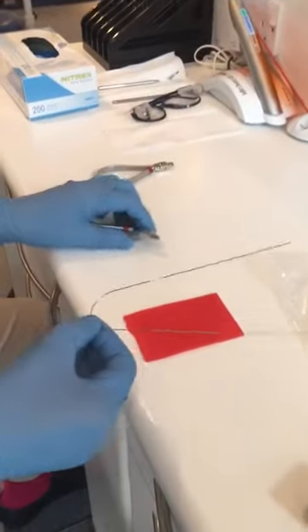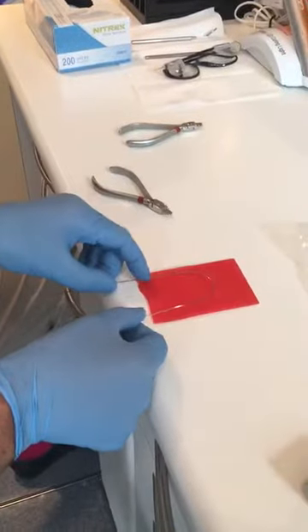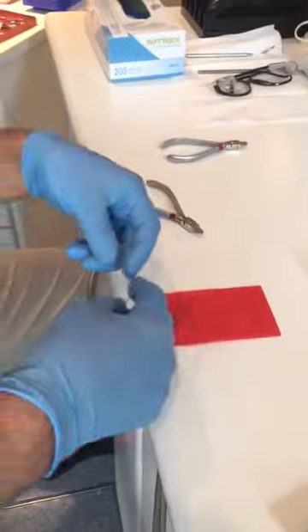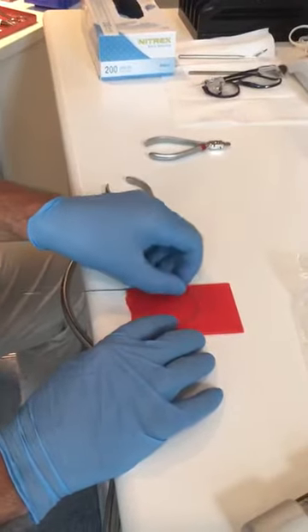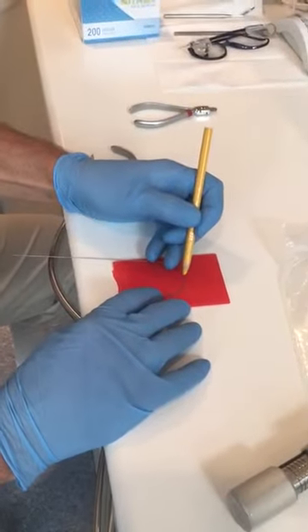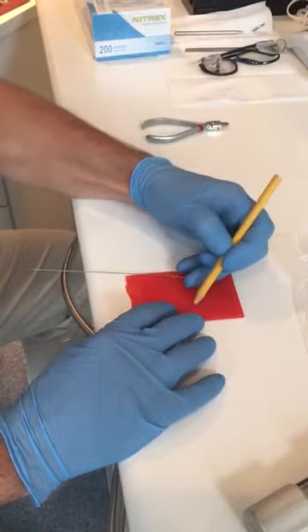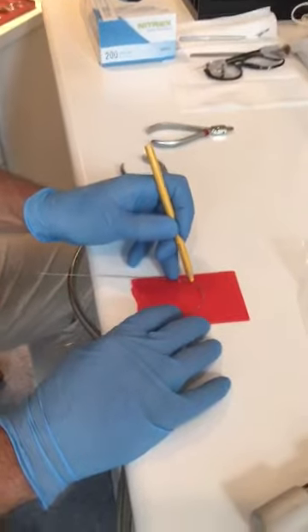Okay, so what we need to do now is we need to apply that torque. Could I have a yellow pencil, please? Apply that torque as palatal root torque on the upper anterior. So make sure you put it the right way around. Thank you. And then you mark the midline of the wire, and you mark the distal contact point on the lateral incisor on both sides.